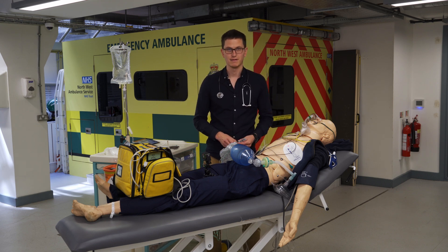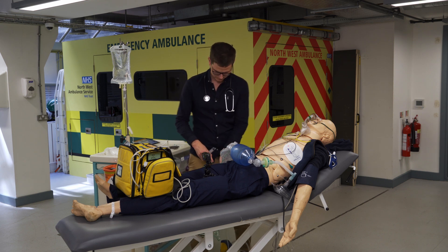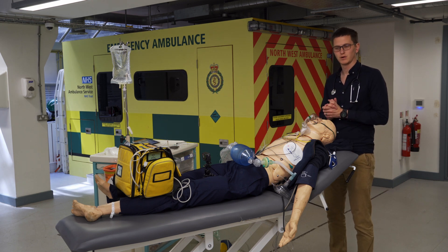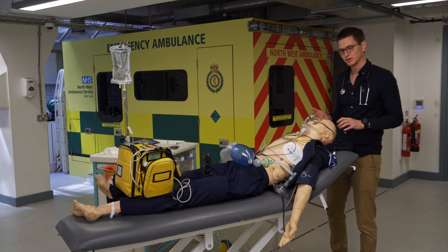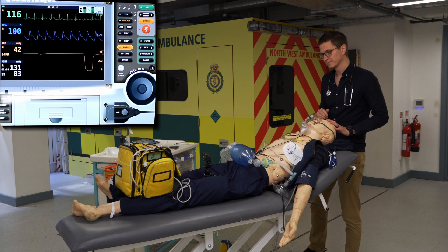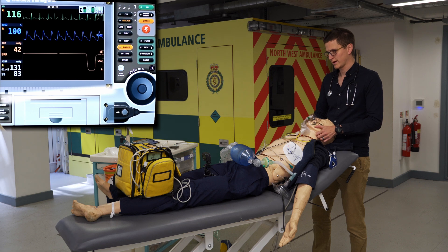We're going to start with the fentanyl, then the ketamine, then the ROC. Now we start a one-minute timer and we wait. We're not going to take off the mask or remove anything — we're waiting for the drugs to work. ROC will take about a minute to work. You can assess this by feeling the jaw. We're not giving suxamethonium, so there are no fasciculations. After one minute, watch the capnography. His jaw feels quite flaccid, his breathing is slowing down, and now his breathing has stopped — he's apneic.